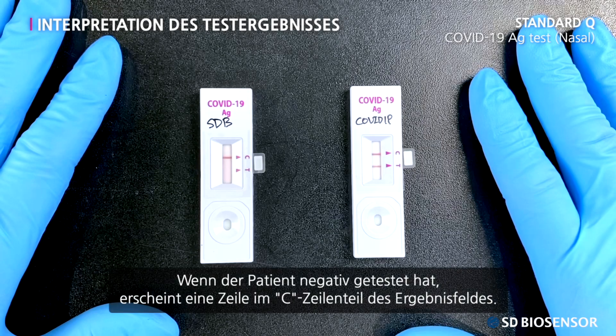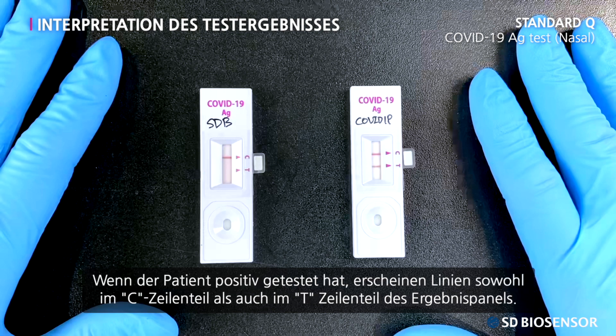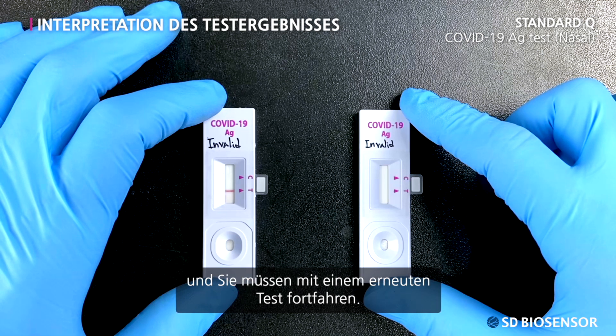If the patient tested negative, one line appears in the C line part of the result window. If the patient tested positive, lines appear in both the C line and T line part of the result window. If no lines appear in the C line part, the test is proved to be invalid and you need to proceed with a retest.